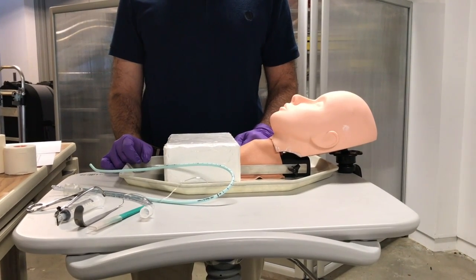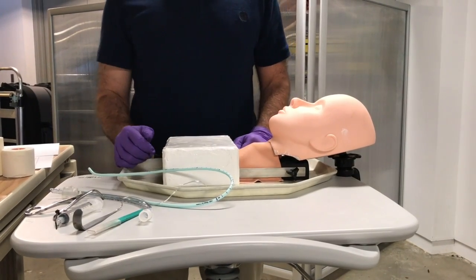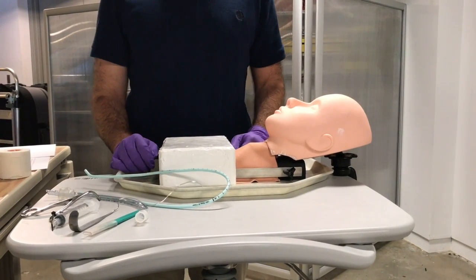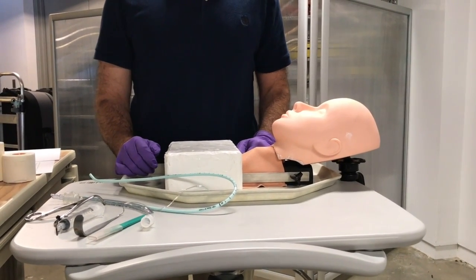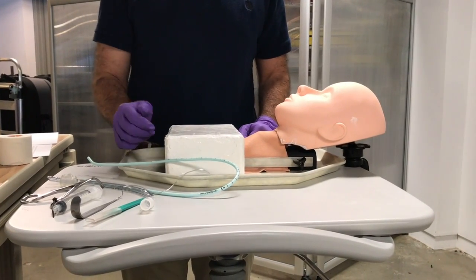The equipment for each technique is variable, but if you have a scalpel, a trach hook, a 6-0 ET tube, a Trousseau dilator, and a bougie, you can perform any of the different techniques. At the very minimum, I would recommend at least having a scalpel, a 6-0 ET tube, and a bougie.